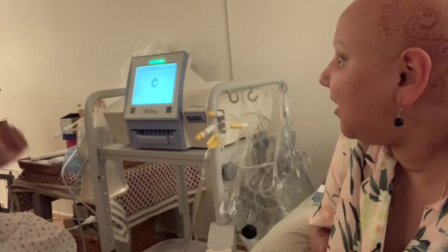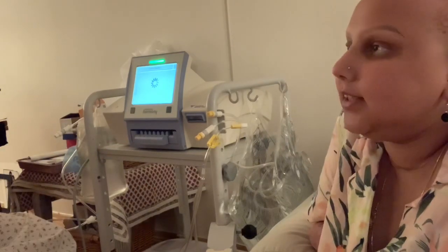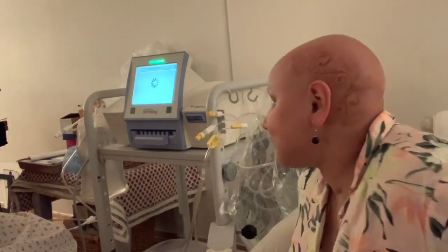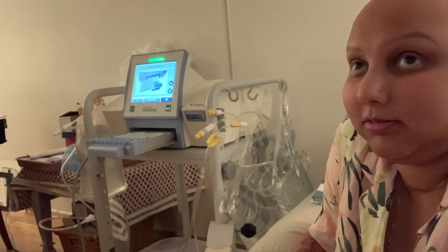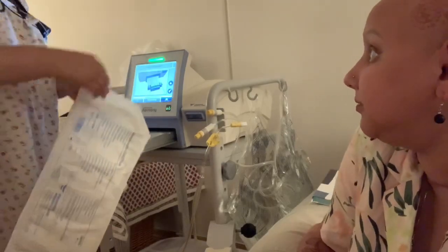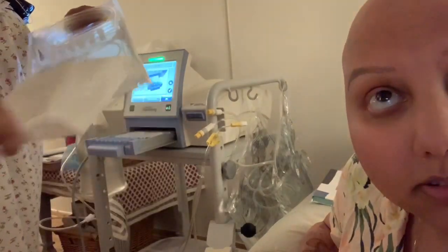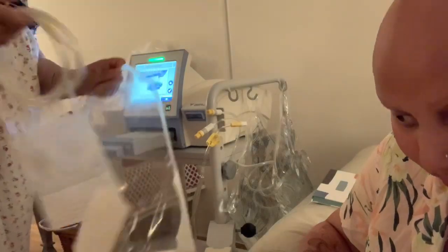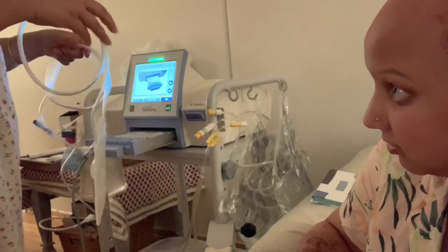Okay, you can see the tray coming out slowly but surely. It has a history of not always coming out. We don't touch it ourselves — the same process applies: be extra, extra careful with anything going into the machine. There's a little video on screen showing what I'm supposed to do. This part should not be touched, and if I do I'll have to start the whole process again. Also, these wires should not touch the ground.